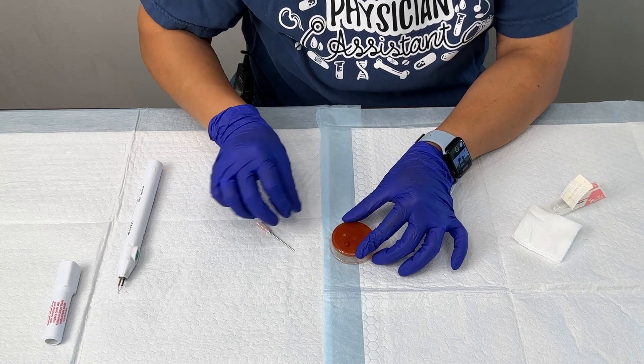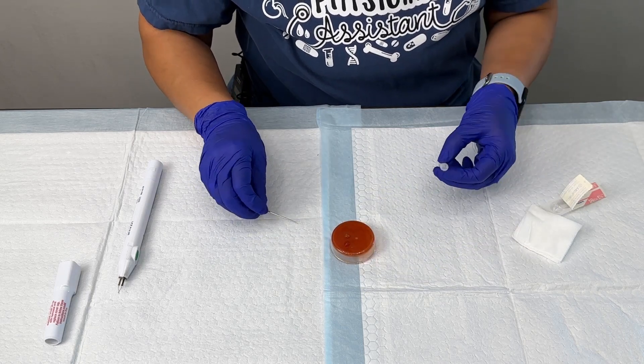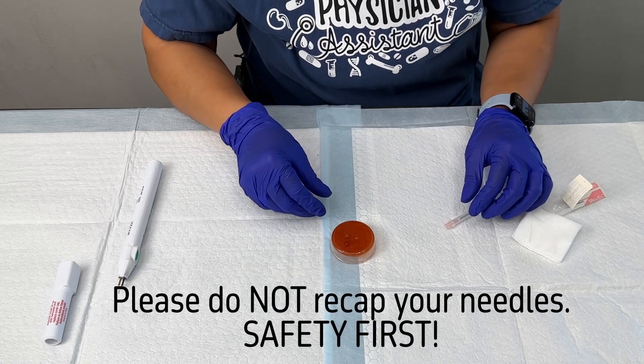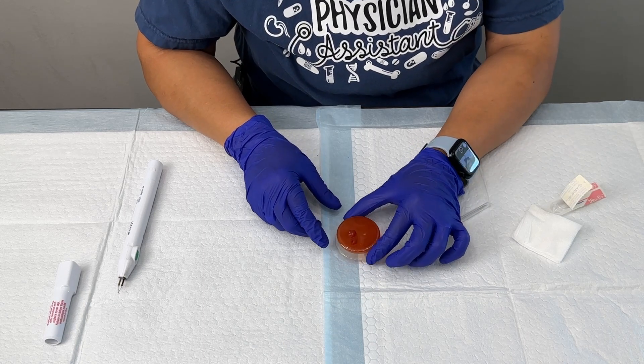Once you get through, you'll see that blood start to come out, and that's how you know that you are in the correct space. Usually these subungual hematomas are under quite a bit of pressure, so you'll see the blood just start to come out — and that's how you know you are in the correct space.